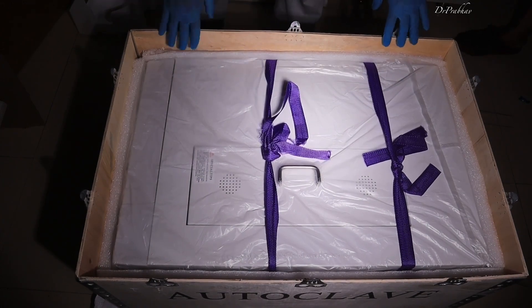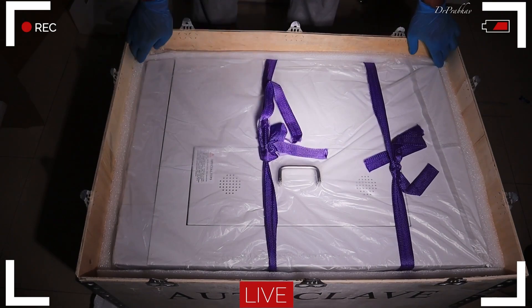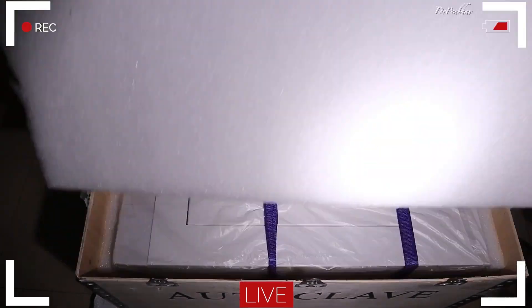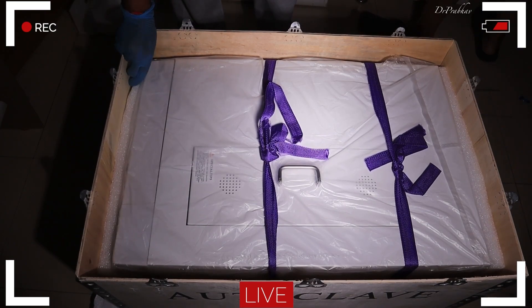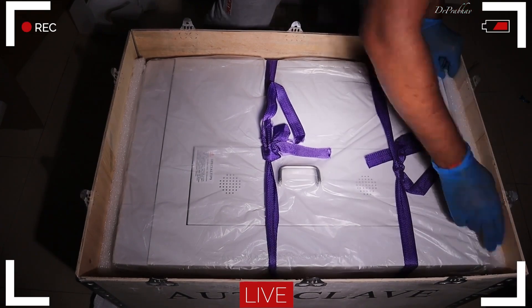Hi friends, today we received the packaging from Confident Dental Bangalore. This is an autoclave named the Turline Plus. We are just unboxing it and we will see how it looks, how we need to use it, and what are its proper usage instructions. So let's unbox it and see.